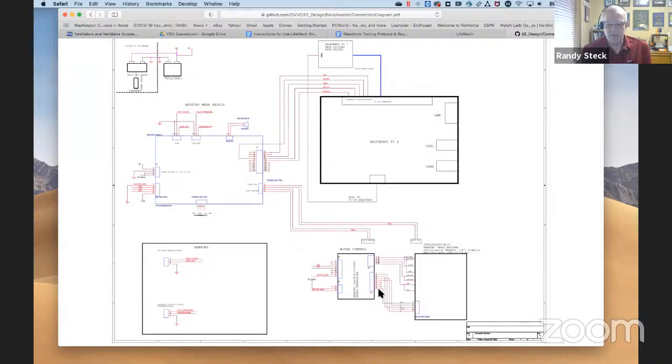To that end, we used a strong industrial supplier, Nanotech, one of their more powerful stepper motors, and basically overkilled the requirement.